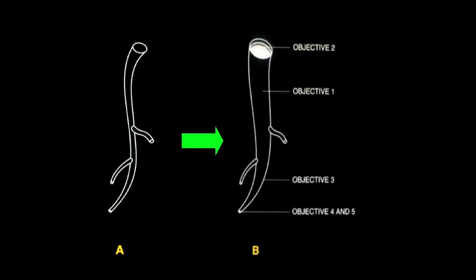Let's illustrate the Schilder principles of cleaning and shaping. So on the left is a drawing of a root canal system that doesn't have any shape. And Schilder taught us to make a continuously tapering funnel shape, objectives 1 and 2, allowing restrictive flow of material moved apically so that it would seal apically and laterally. Objectives 3, 4, and 5 have to do with preserving the flow or the original contours of the root canal system, as well as preserving the position and the size of the foramina.